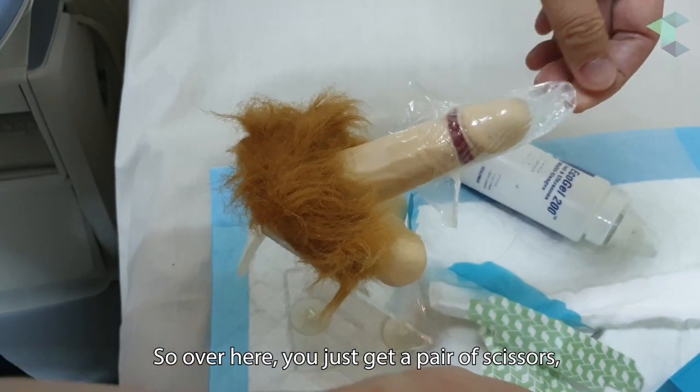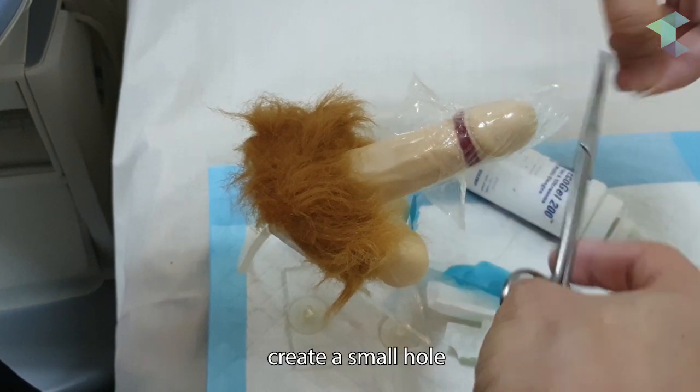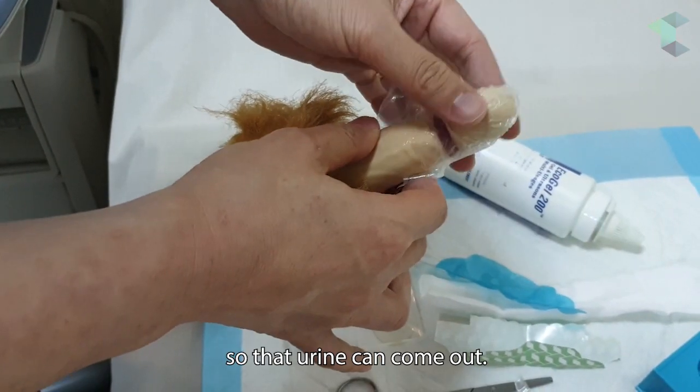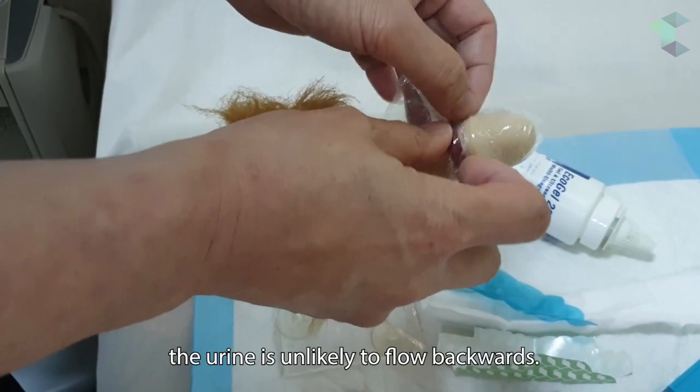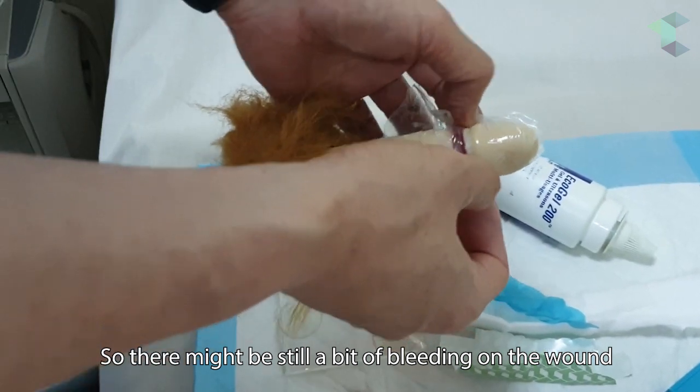Over here, get a pair of scissors and create a small hole so that urine can come out. Because of the ointment inside, the urine is unlikely to flow backward.